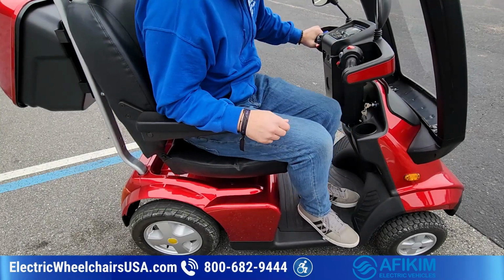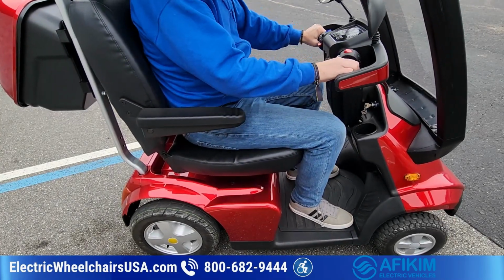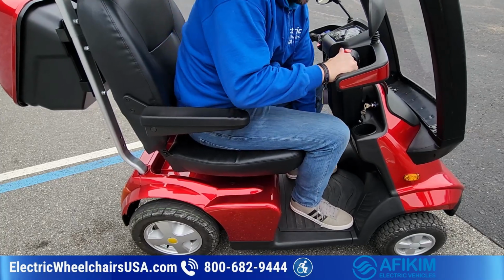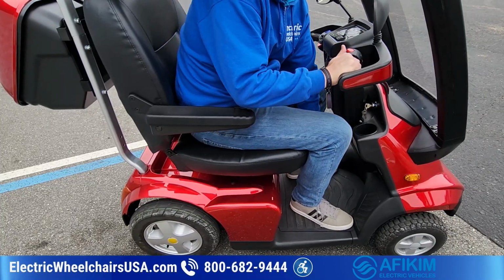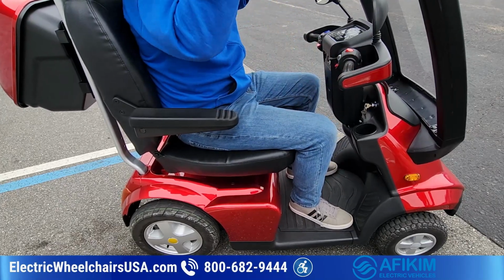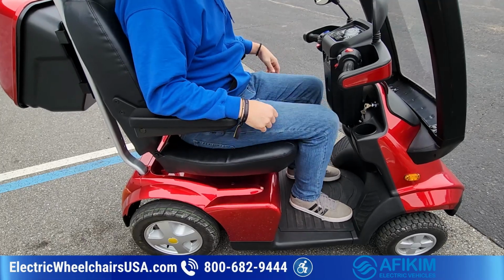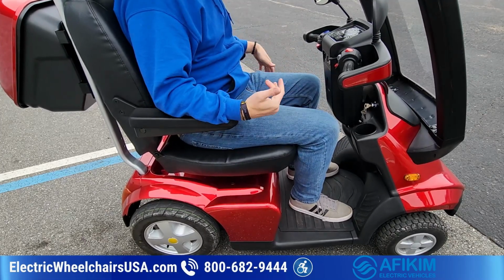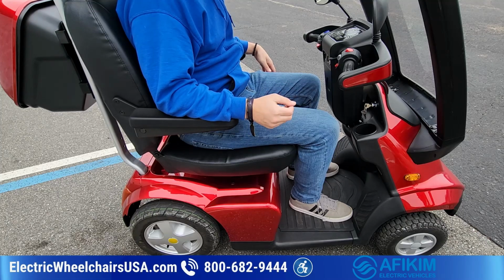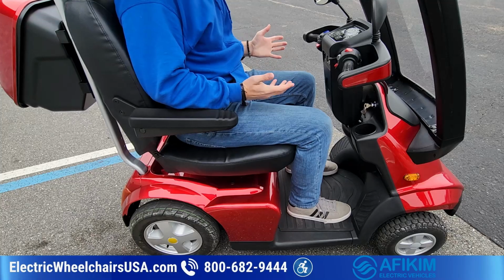I think on this 24-inch wide seat, if you have the canopy on, you're limited with how much you can slide the seat forward. So that's as much as I can slide forward, and that's as far back as I can go. If I didn't have the canopy on, I could scoot it back much further, and my knees wouldn't get in the way. So I would recommend, if you want the 24-inch wide seat, I mean, I'm also tall, so I'm 6'4", I'm a tall rider.